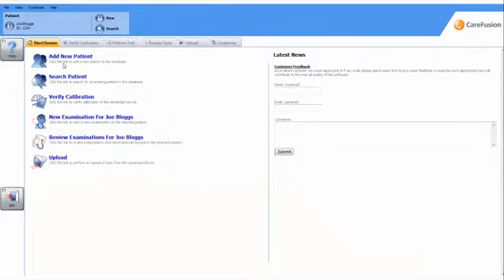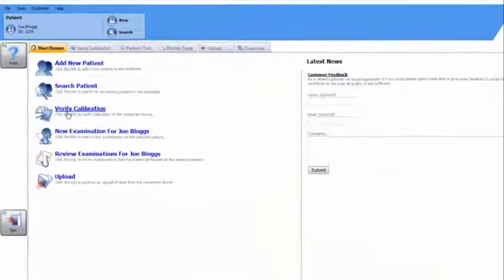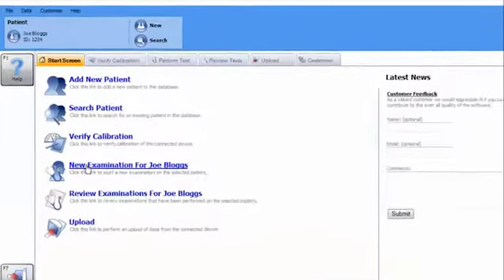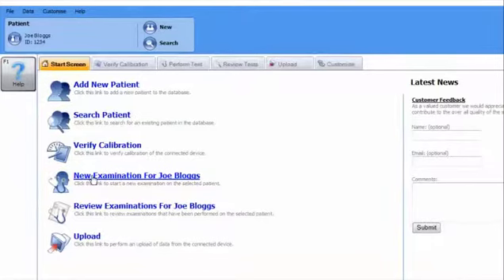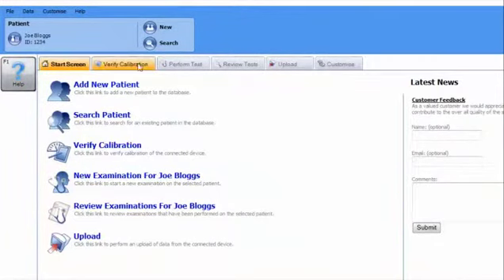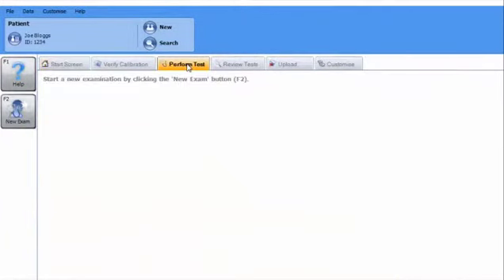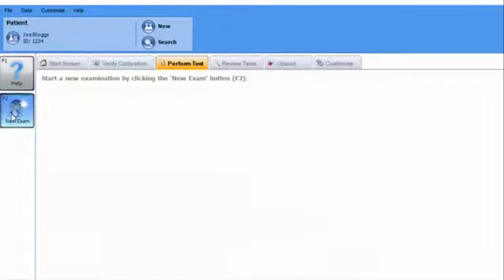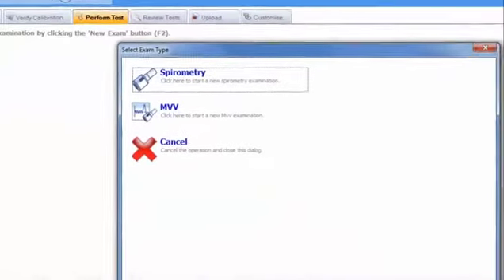To perform an MVV test on a patient, either click on New Patient to select him or her from the database, or select New Examination if the patient's already been selected.